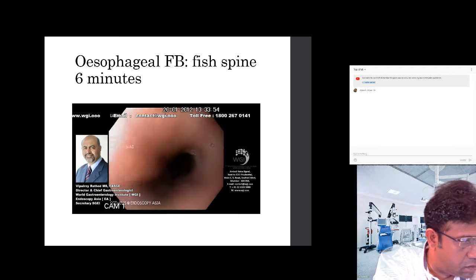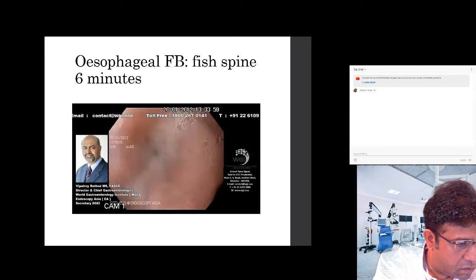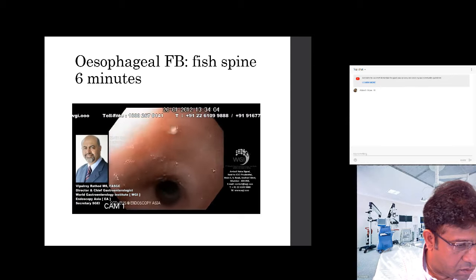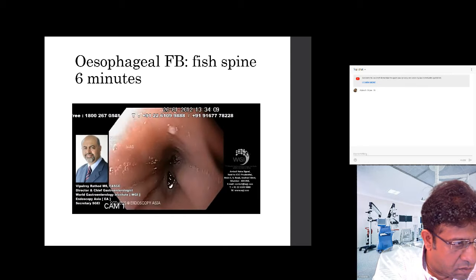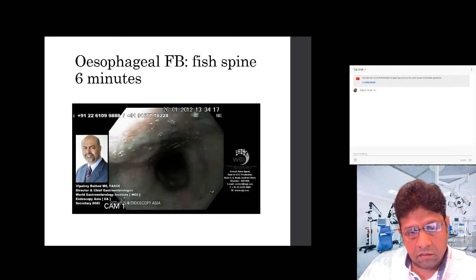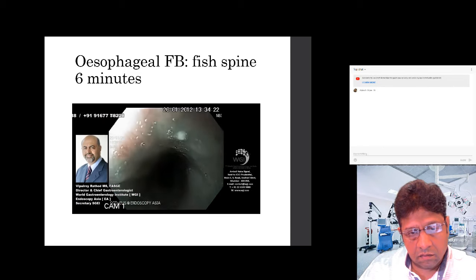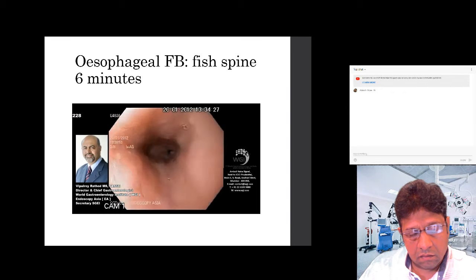She's a known diabetic, so whenever a patient has diabetes, we have to rule out fungal infection, candida, which can lead to dysphagia. There is some evidence of mild fungal infection also. Here you can see some candidiasis. There is no doubt about it. There is partly some fungal infection here, which you can see on NBI in the upper esophagus. So this can add to her symptoms, number one. And let us find out if there is any other lesion in the esophagus because of her age.